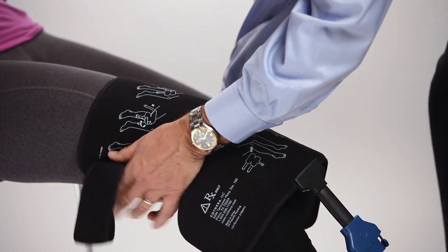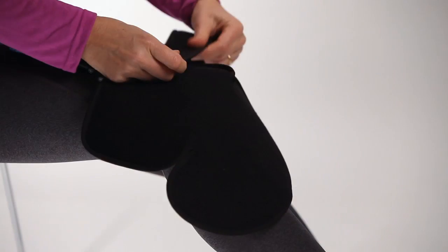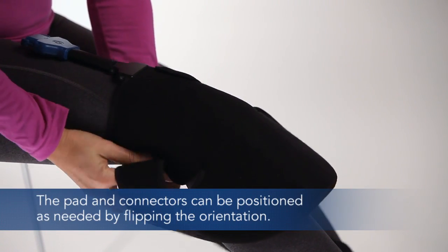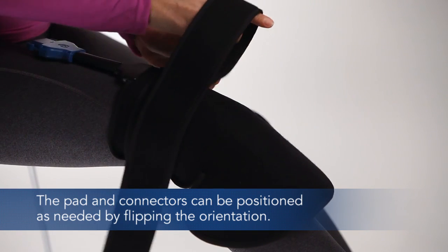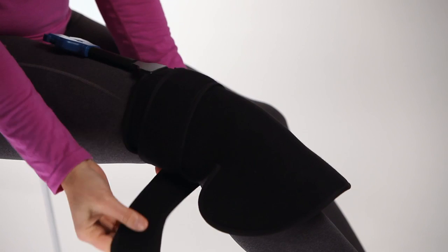Strap the knee pad so it is centered and fits snugly over the knee. The knee pad may be positioned differently if you want to route the tubing set another way. The pad should be secure but does not have to be overly tightened.